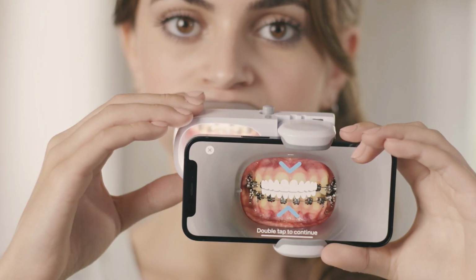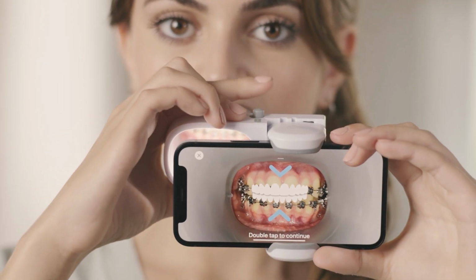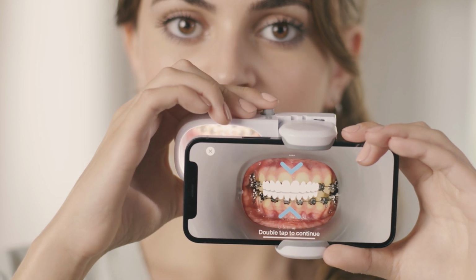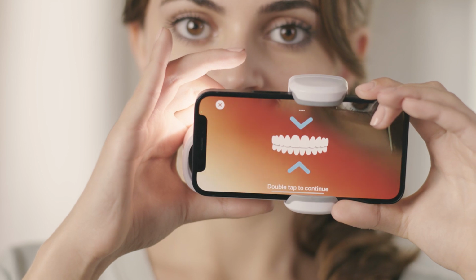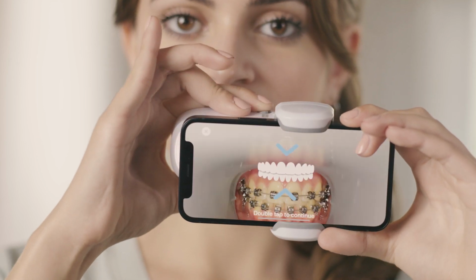Your teeth and gums should be fully visible without causing discomfort. Make sure your teeth are in the center of the camera screen. If not, you may need to adjust the position of your phone by sliding it for vertical adjustment. During the scan, audio instructions will guide you through the steps.